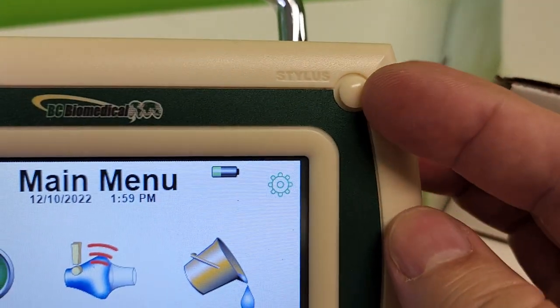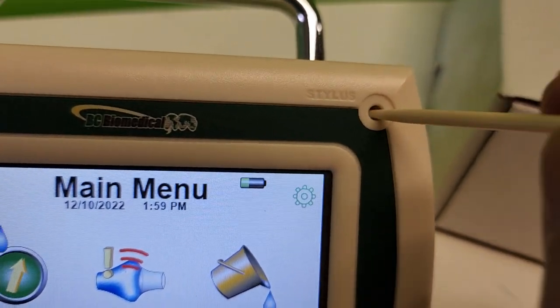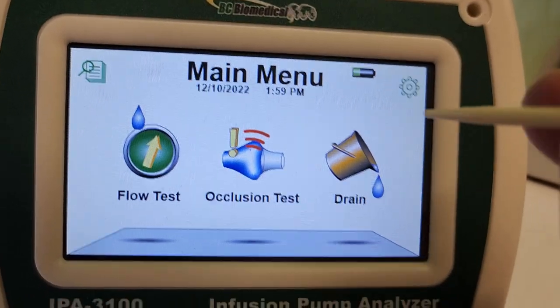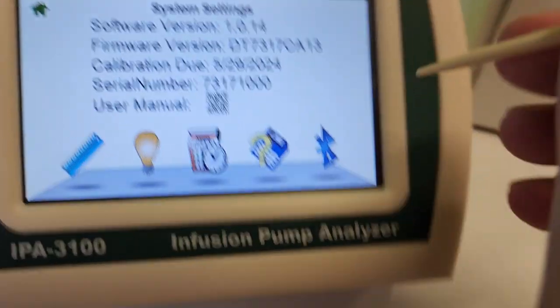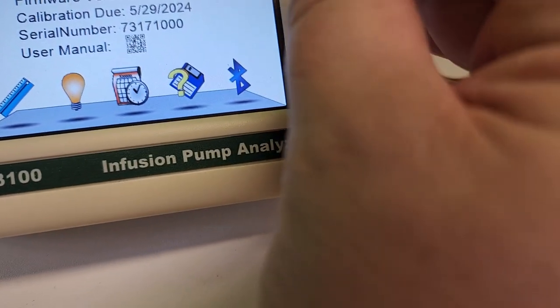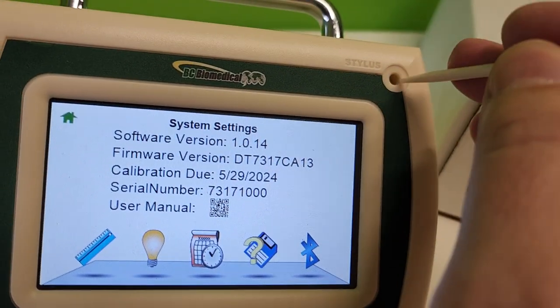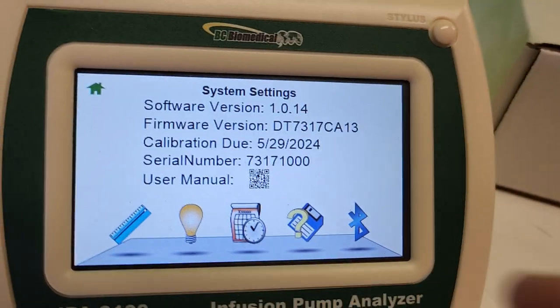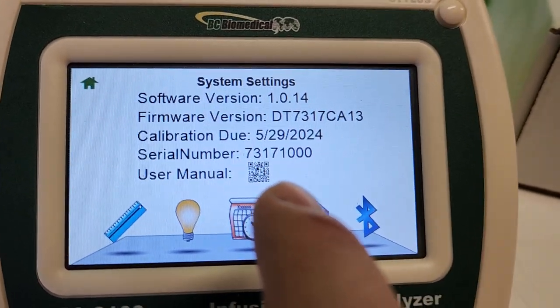There's a little hidden thing right here - look at this, a stylus! This is pretty cool because some of us have fat fingers. Let's try it - oh nice, that feels like a resistive touch screen. I'm going to put the stylus back in there.